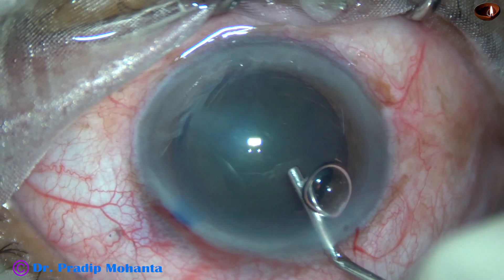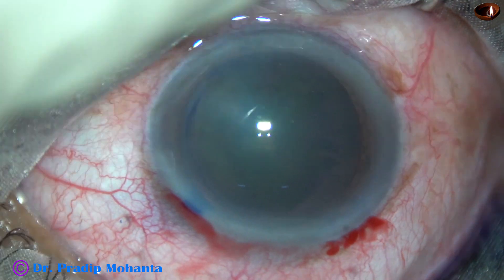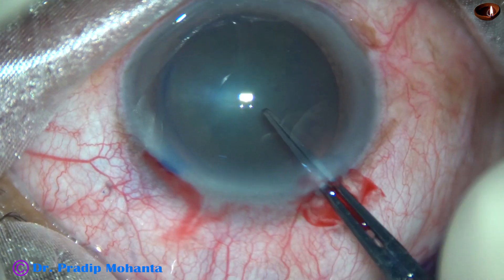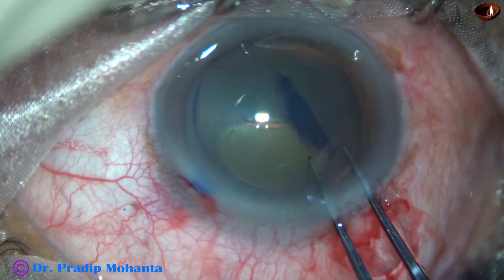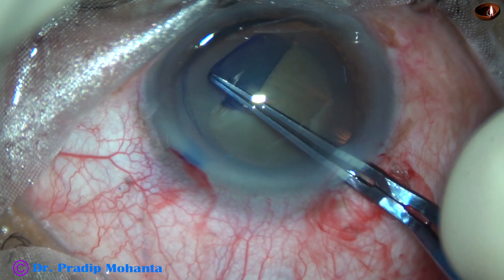Visco is used to fill up the anterior chamber — this is 2% HPMC. A utrata forceps is being used to do capsulorhexis. The anterior capsule is torn and a capsular tag is raised. This capsular tag is guided anticlockwise all around to complete the rhexis.